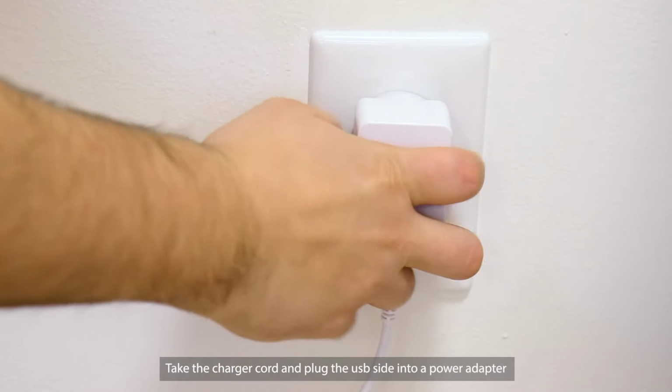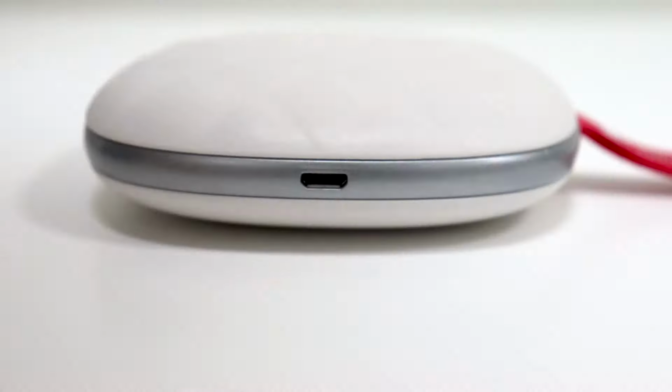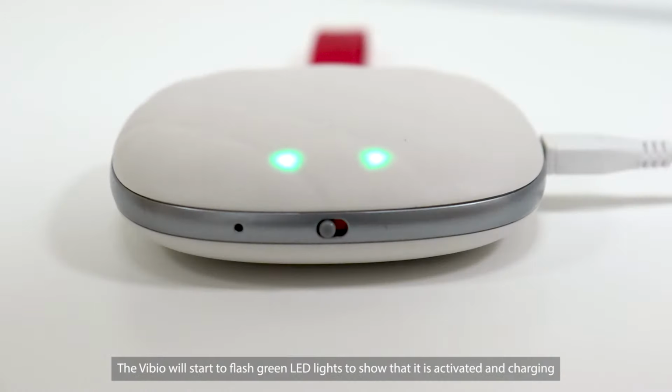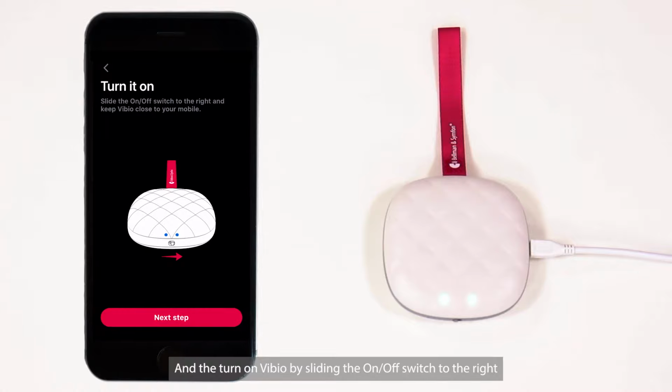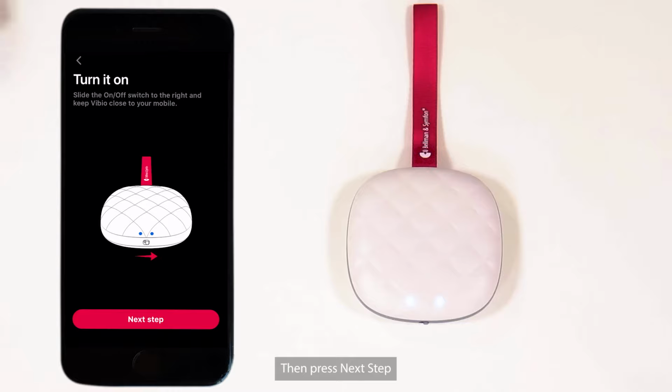Take the charger cord and plug the USB side into a power adapter and into an outlet. Then plug the other side of the cord into the charging port. The Vibio will start to flash green LED lights to show that it is activated and charging. Press Next Step. And then turn on Vibio by sliding the on-off switch to the right. Then press Next Step. And the app will begin searching for your Vibio.